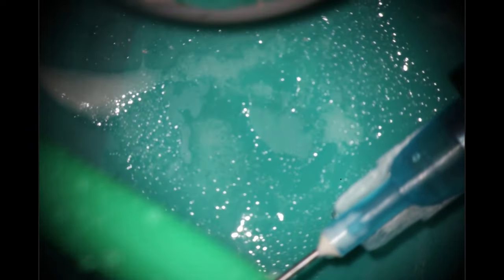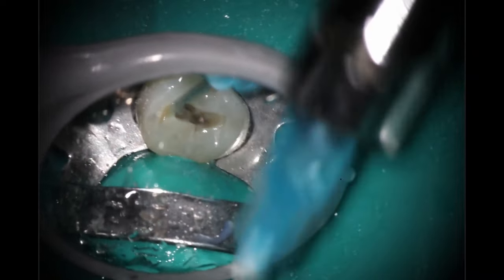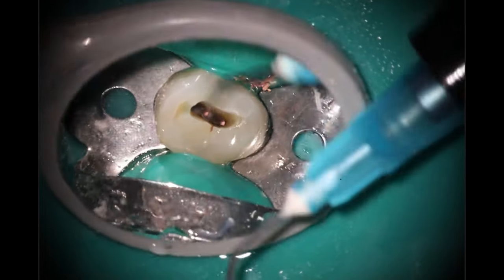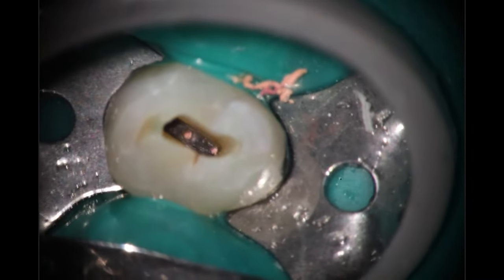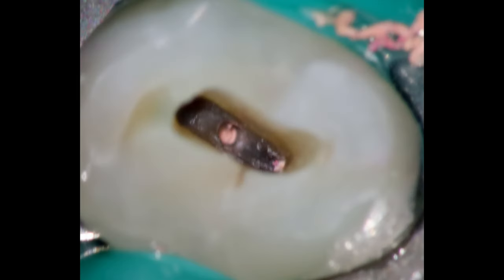I like to take my picture right after the etch because it gives you that really nice matte finish. I've noticed that matteness has actually increased after using the blaster, and it really does create these beautiful photos where everything looks nice and clean with no glare. And you can see — we got both canals looking great.